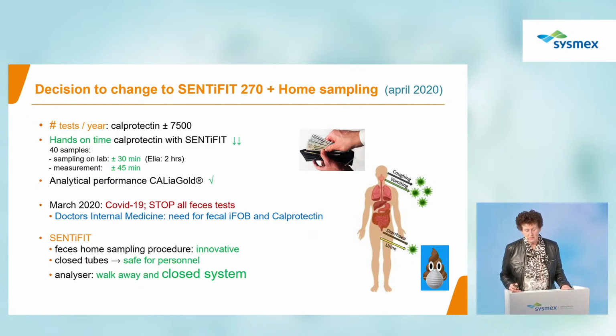And we had the approval of the clinical doctors who said, well, go with the system, and we will see what it will do. Without the study comparing the sample from the lab technician or the patient, we moved directly on to fecal sampling at home. And we said, well, we will do that in a later phase.